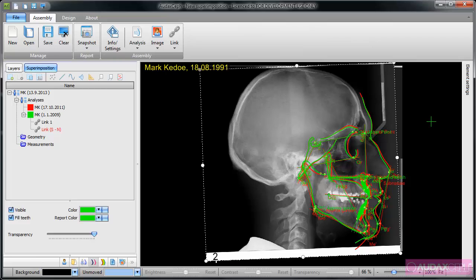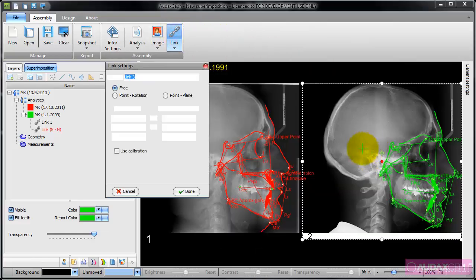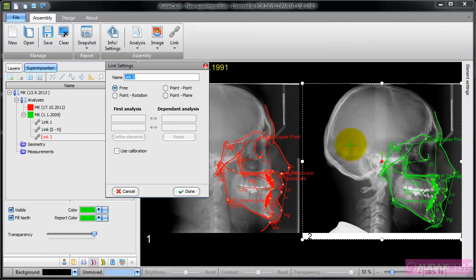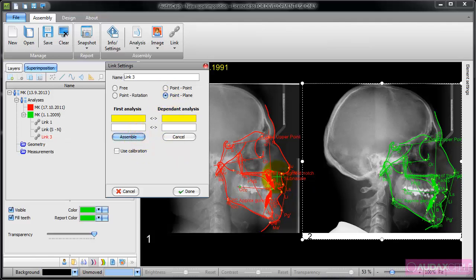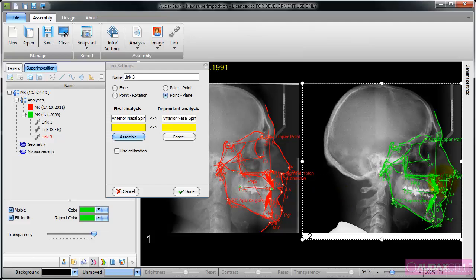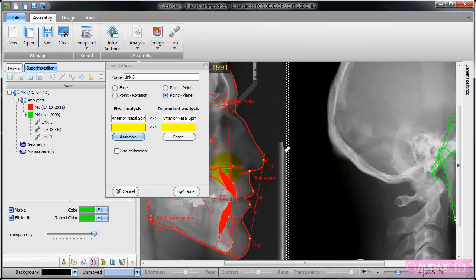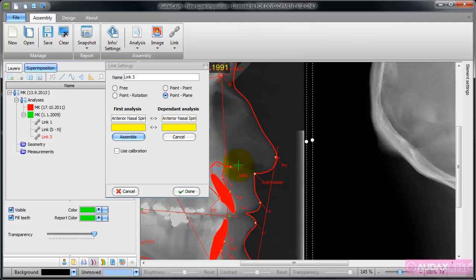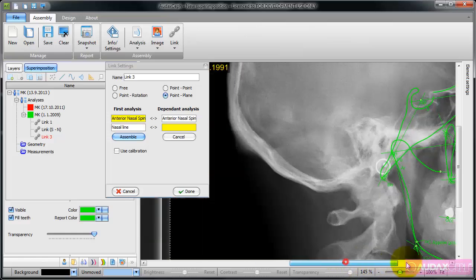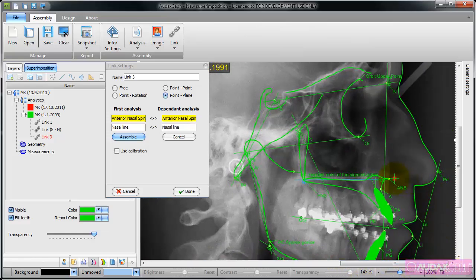The second superimposition that I will create is anterior nasal spine and nasal line. In this case I choose point and plane and define elements. So here is anterior nasal spine and anterior nasal spine here, and the nasal line and the nasal line.